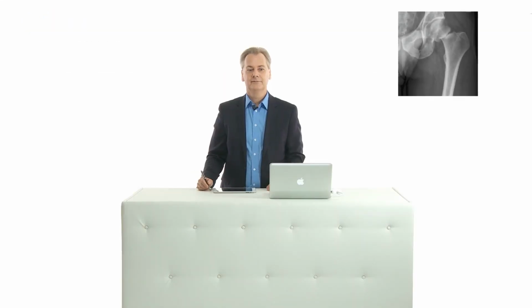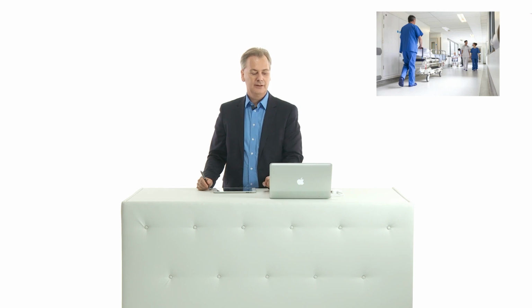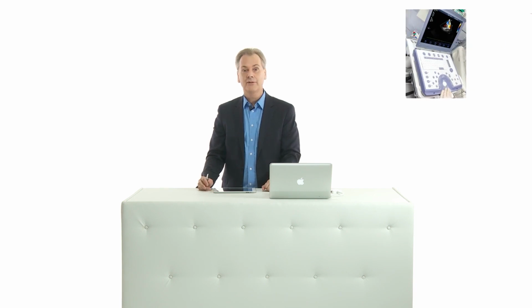This is Frida. Frida is 72 years old and she tripped over a carpet and broke her leg. She was brought to the emergency ward and a young attending physician did the pre-operative examination and found out that there was a faint murmur. Now, the anesthesiologist saw the patient and ordered an echo. We did an echo and this is the study.